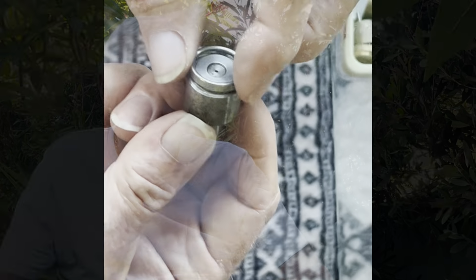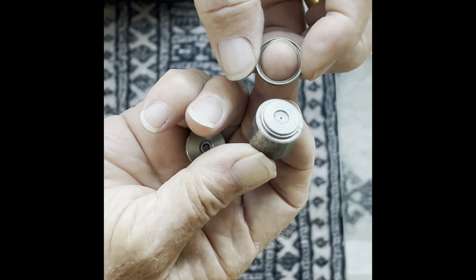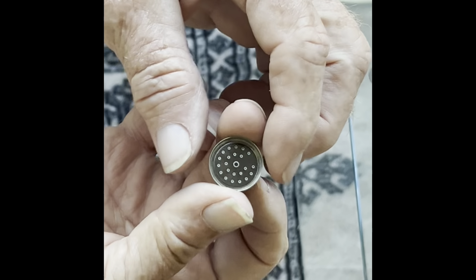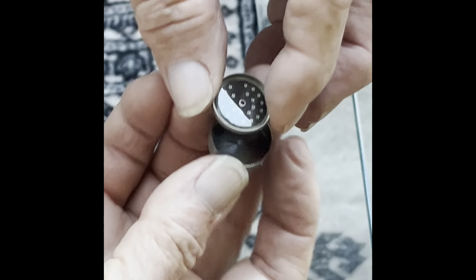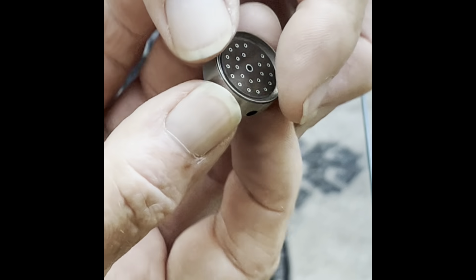I turned these out of a solid 1 inch diameter bar of titanium, and they turned out very well, but the ceramic had to be fitted to that. So then there was a little cap that I made that was extruded. I made a little extrusion die and extruded it. It was like a U shape, circular but U shape in section, extruded to the same diameter as the outside diameter of the ceramic. And they got this brazed in with a hermetic seal once again, and then that just fitted nicely into the can that I'd made out of the titanium.